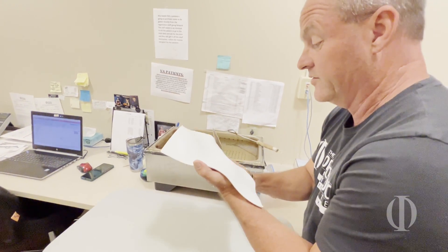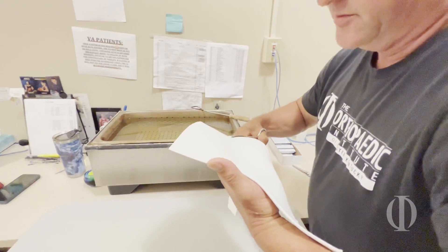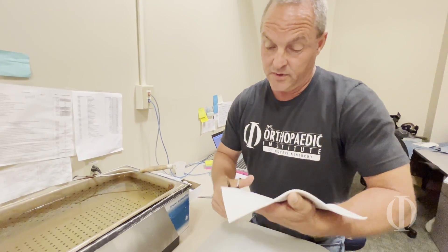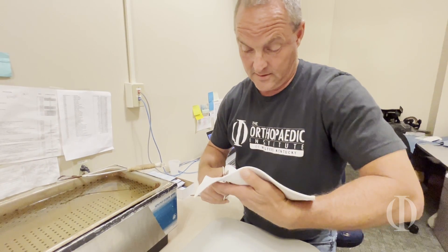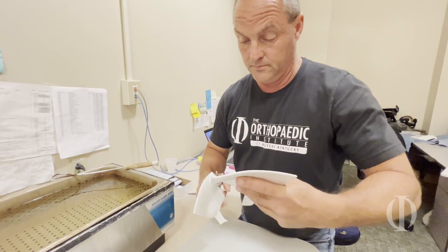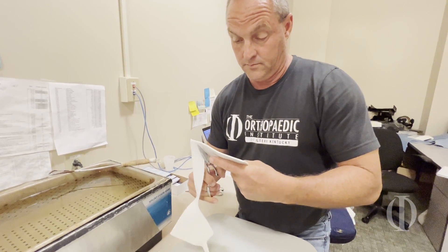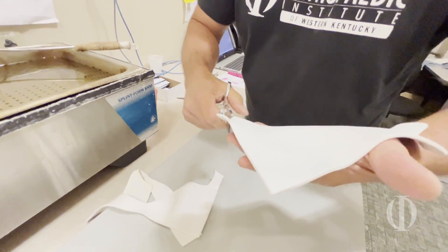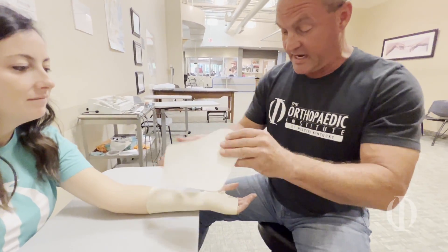People don't understand why we're so protective of our scissors. This material that we're using is called Easy Form — I guess because it makes it easy. My splint material is nice and warm now.